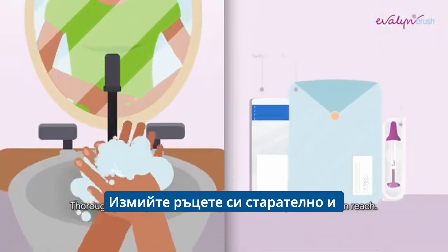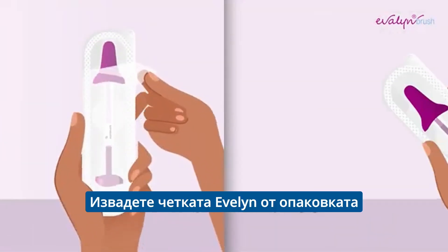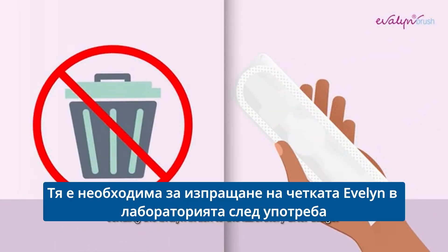Thoroughly wash your hands and lay down the Evelyn Brush within reach. Remove the Evelyn Brush from the packaging. Do not throw the packaging away, as it is necessary for sending the Evelyn Brush to the laboratory after usage.